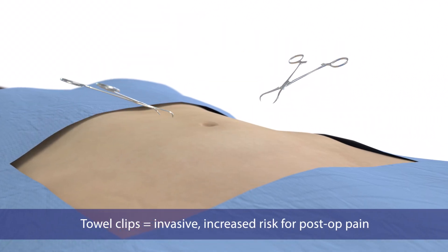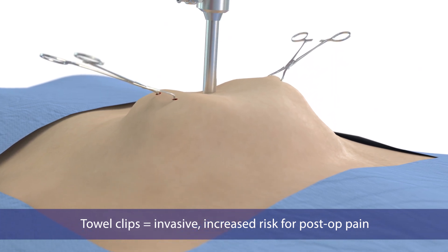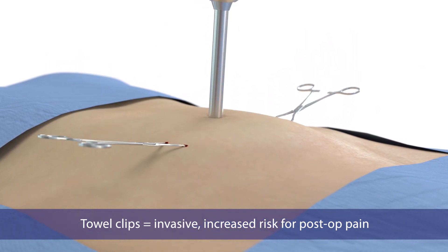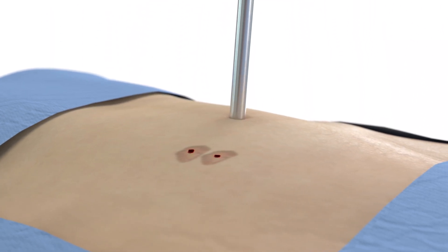Perforating towel clips invasively pierce the tissue to provide a handle by which to lift. The resulting perforations can be an additional source of post-op pain for what is intended to be a minimally invasive procedure.